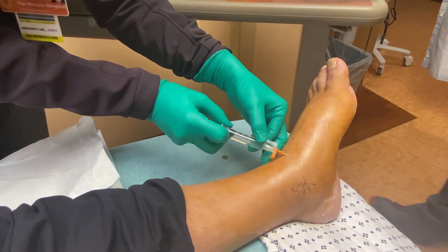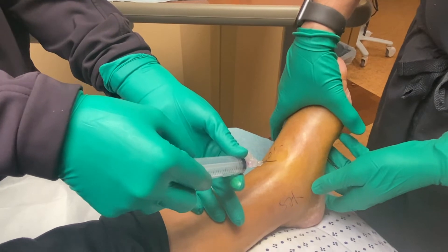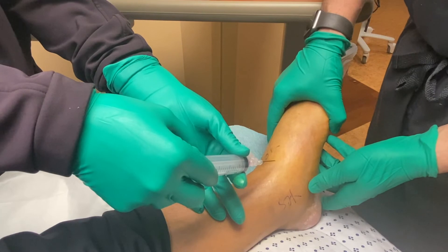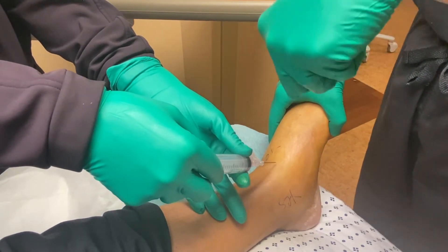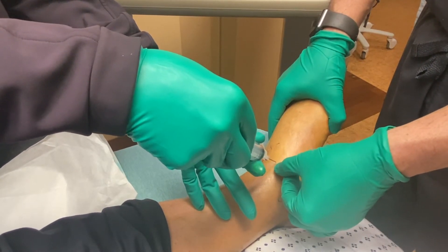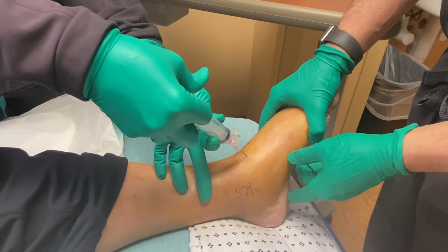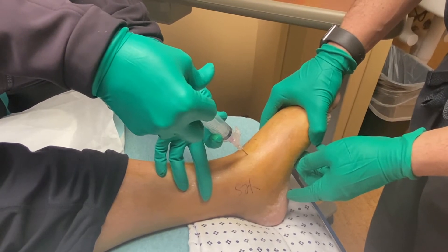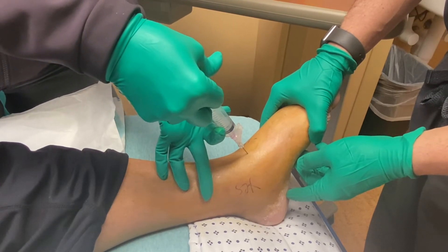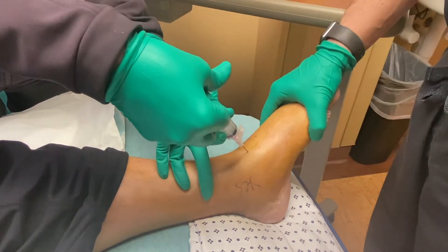Remember to aspirate every single time before injecting. The fourth step is to apply plantar flexion and lateral traction to distract the joint and open the joint space. Use a 20 gauge needle with a 10 cc syringe and insert the needle 90 degrees to the skin. Apply gentle traction on the plunger while advancing in order to recognize when you've entered the joint space.